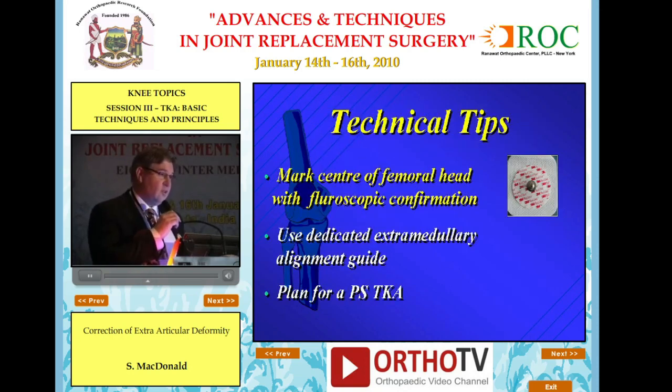So this is what I call the Canadian navigation system. I don't have navigation in my hospital, so I bring fluoroscopy in at the beginning of the case. I fluoro the center of the femoral head, and I stack two ECG leads so I can palpate the center of the femoral head. Is that as accurate as navigation? Probably not. But I'm going to be using extramedullary alignment in these cases because I can't get an alignment rod up, and I need some way to reference the femur if I don't have navigation. So this is the way that we've done it in our place for years.